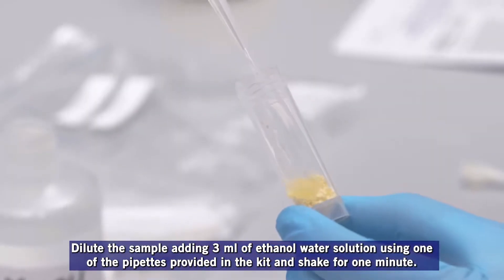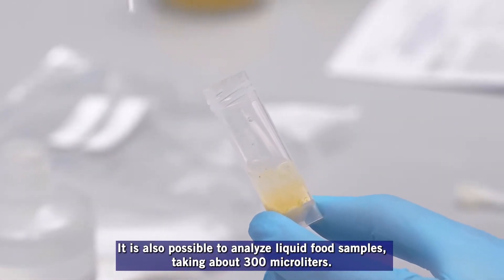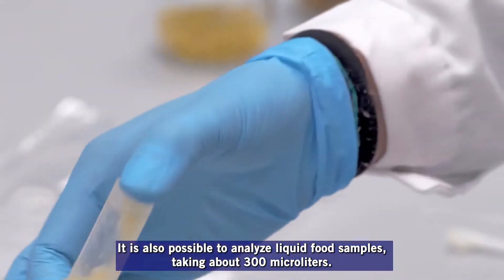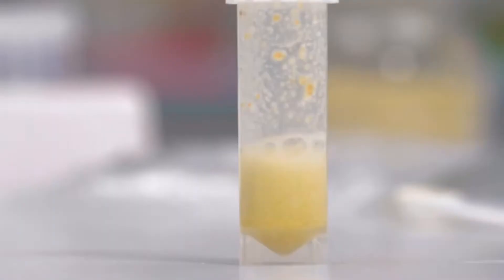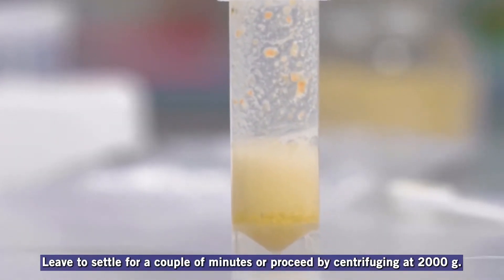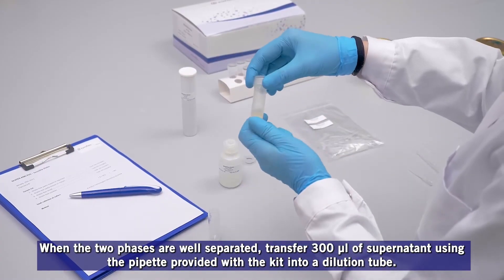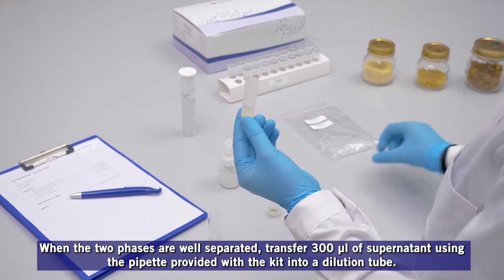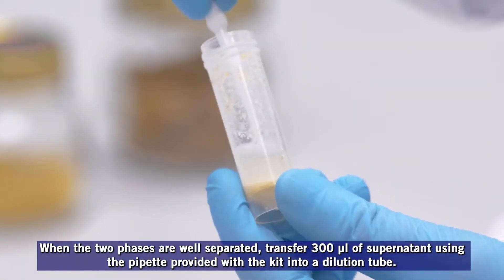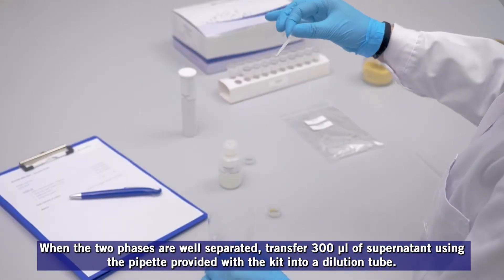Shake for one minute. It is also possible to analyze liquid food samples, taking about 300 microliters. Leave to settle for a couple of minutes or proceed by centrifuging at 2000G. When the two phases are well separated, transfer 300 microliters of the supernatant using the pipette provided with the kit into a dilution tube.